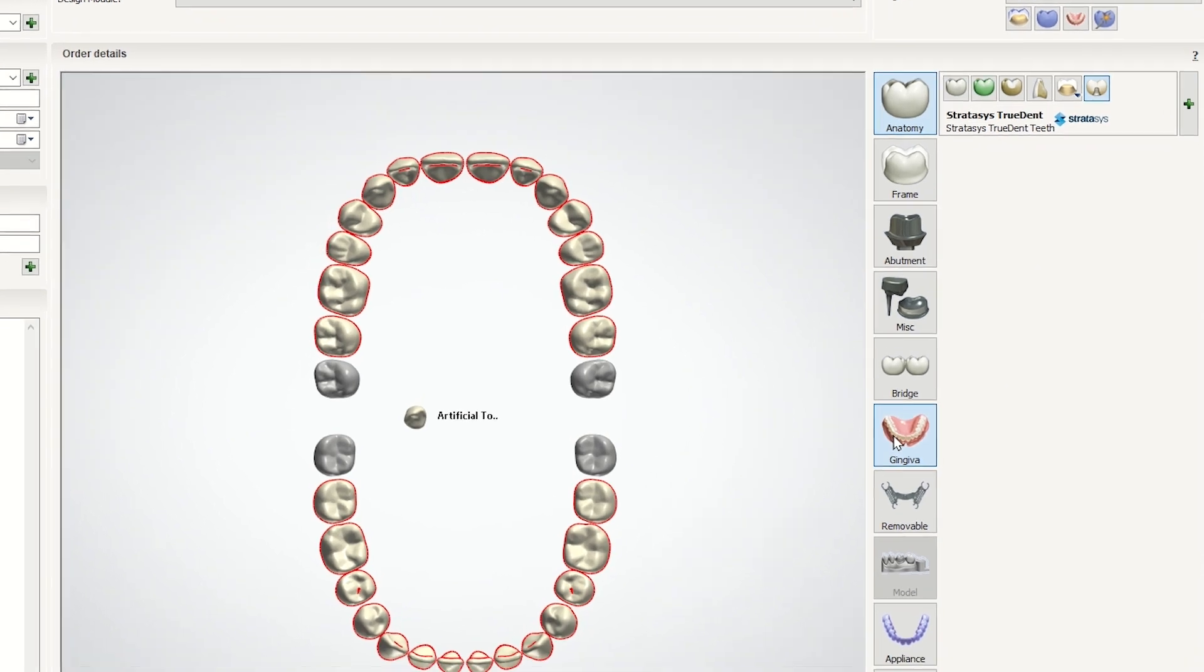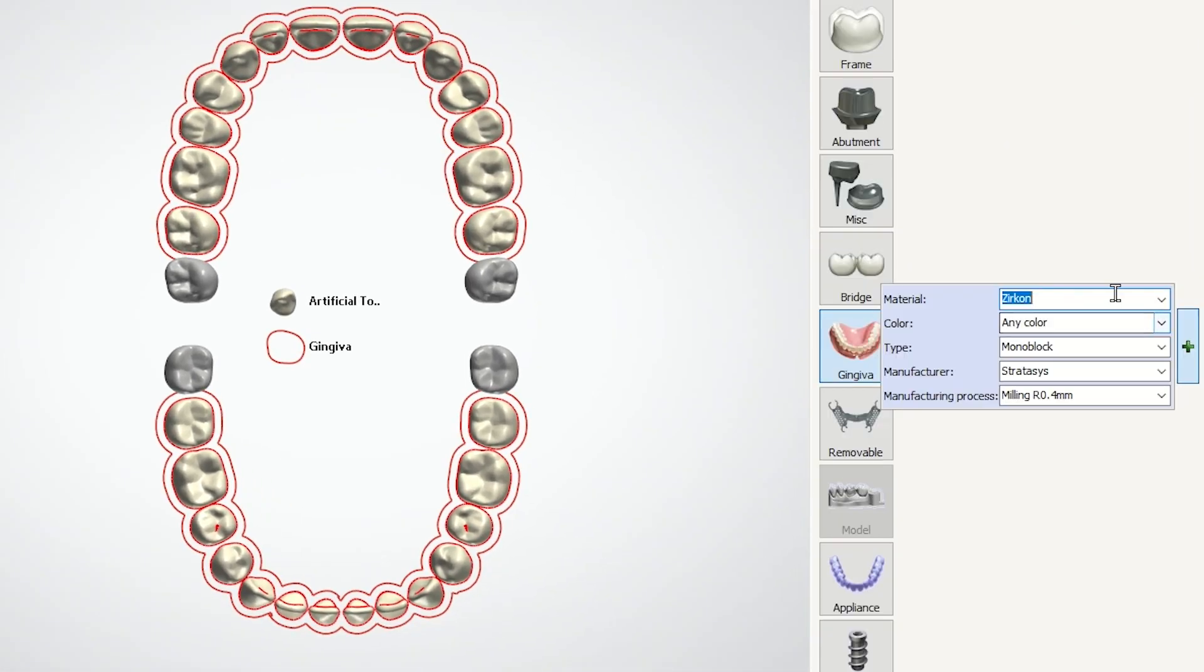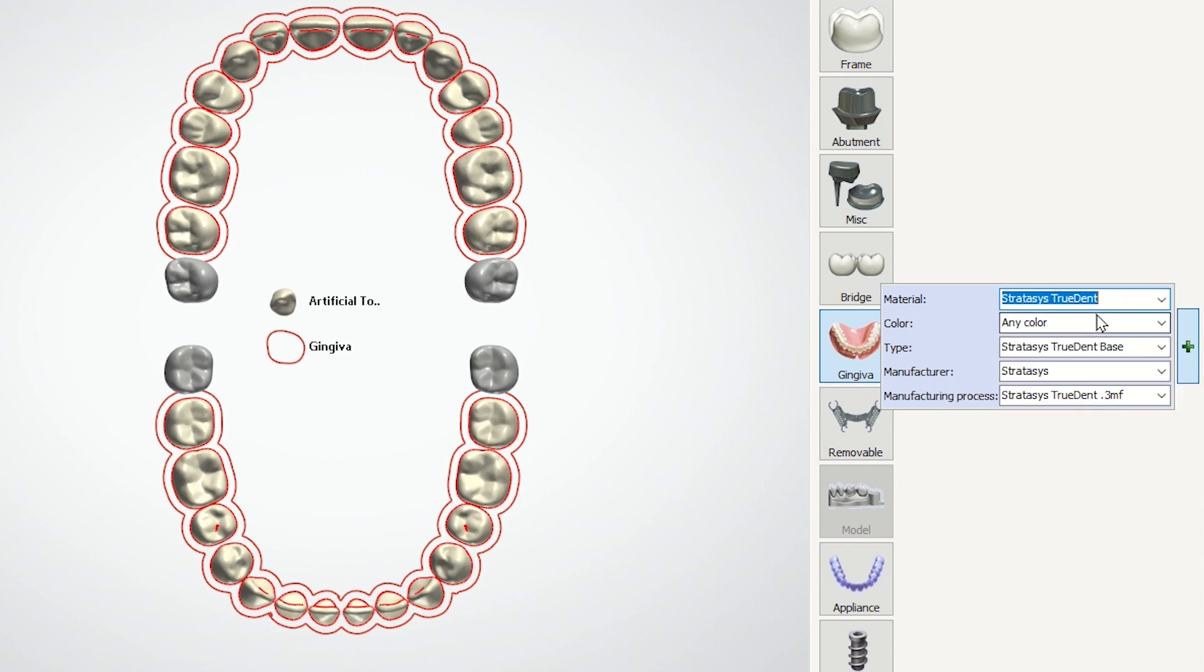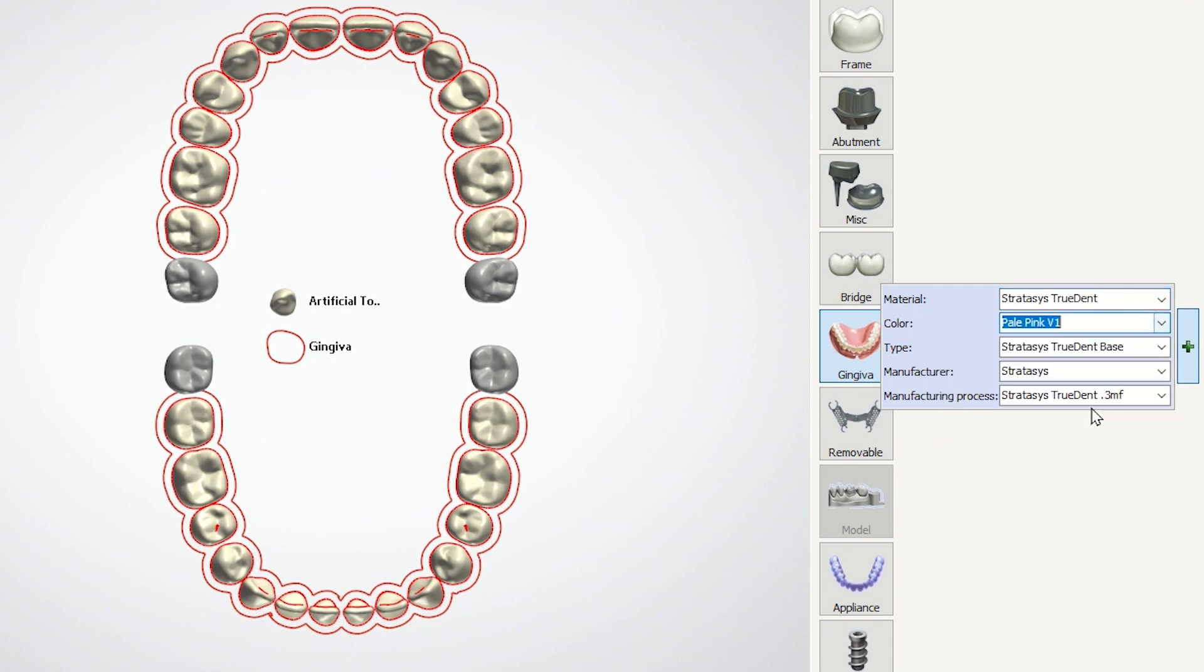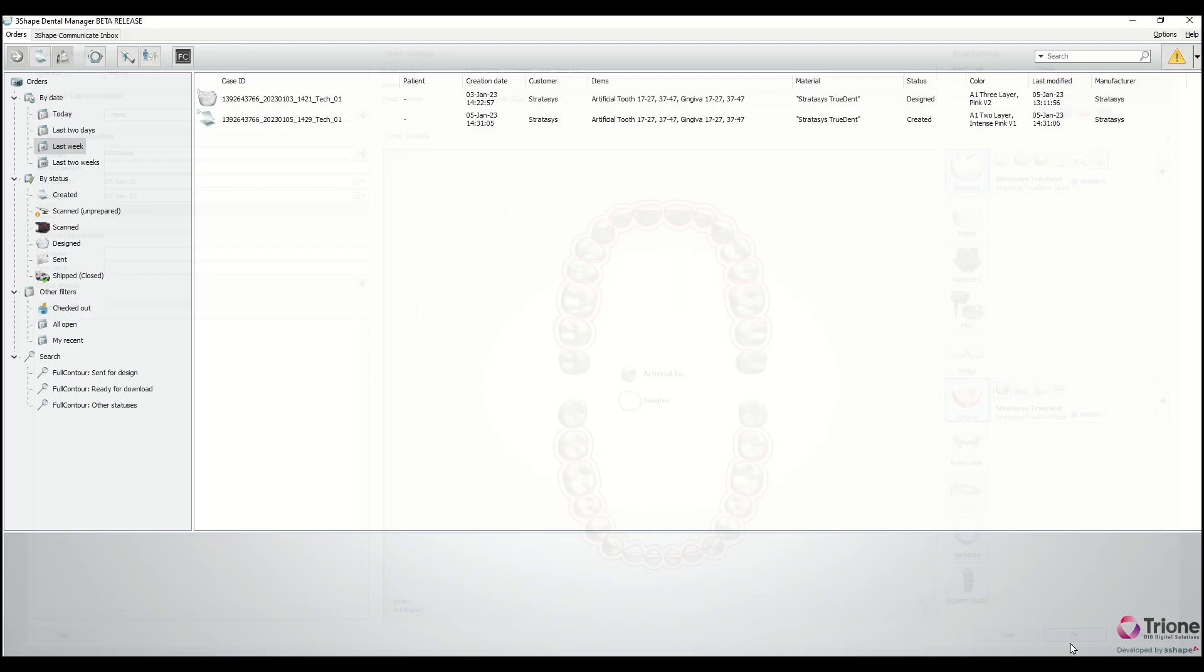Now select Gingiva. Again, the material will be Stratasys Trudent. Select the shade and click OK.